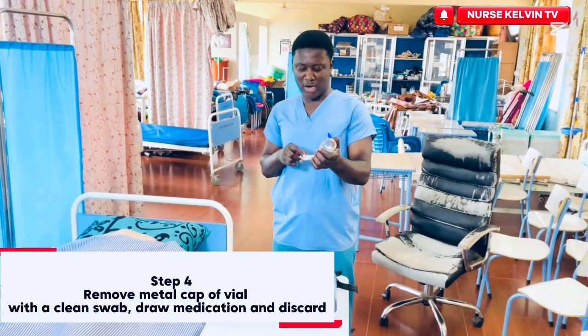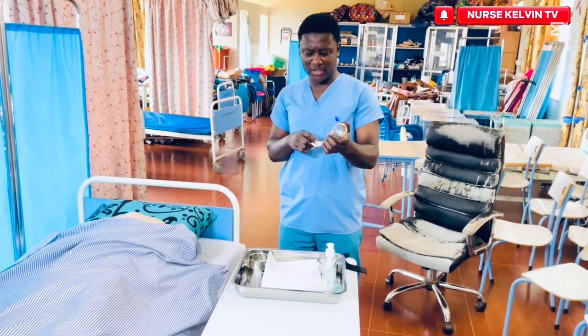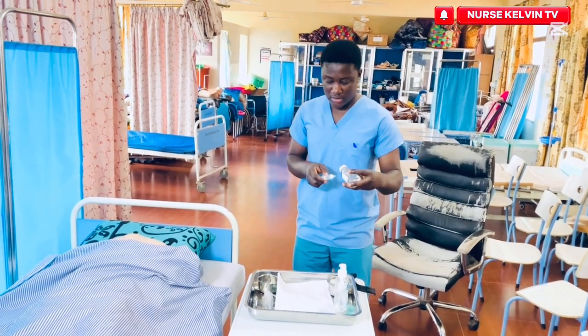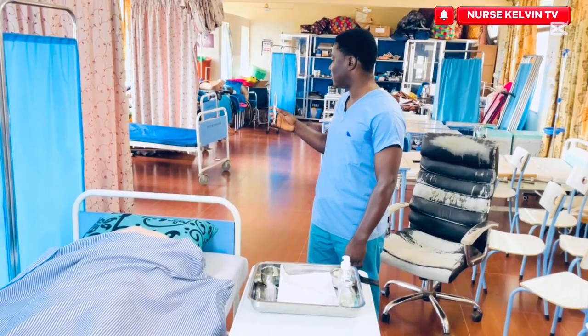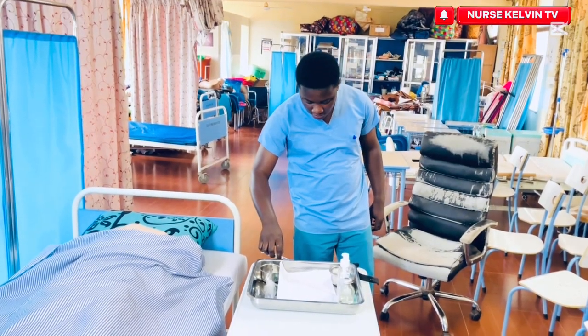Please guys, mind you, in IM medication we don't use gloves. You've seen many people using gloves, but that's not how it is. So we don't use gloves in IM medication. Afterwards, you need to make sure that you expel the air.